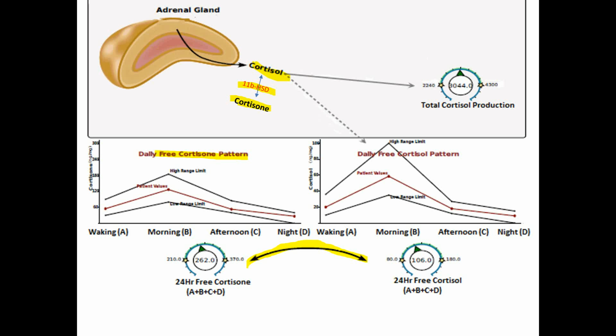So in this case, you've got a low free cortisol overall, and the cortisone can either confirm that or potentially contradict that a little bit. If the patient's free cortisol status is potentially a little bit higher, you might see that a little bit in the cortisone. So we've got the free cortisol going back and forth, active, inactive, and then they both can get metabolized to the end product, which is the combination. The metabolized cortisol is the combination of both the cortisol and the cortisone metabolites, and that's an irreversible reaction. So once it goes to the metabolites, it's just ready for excretion.